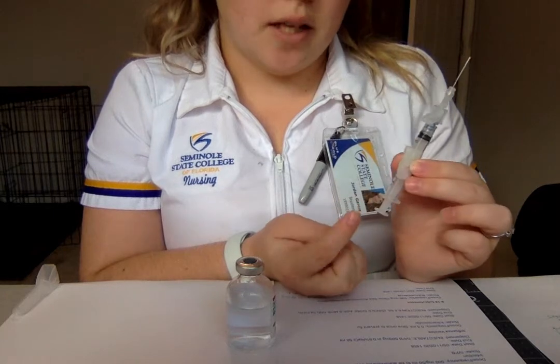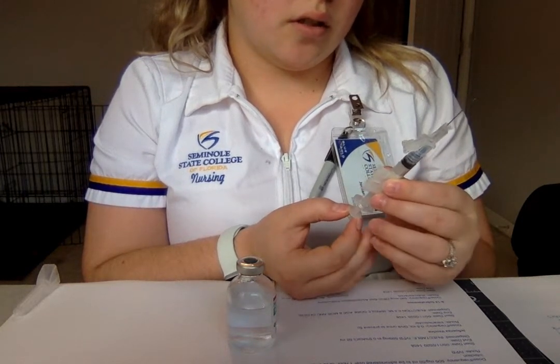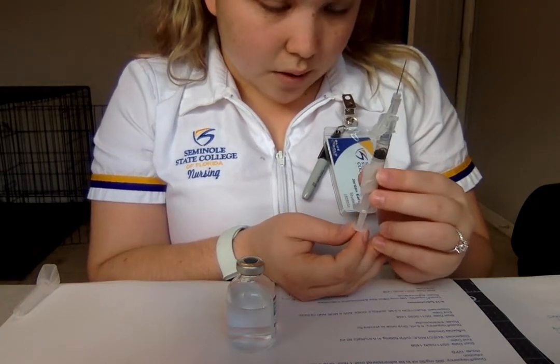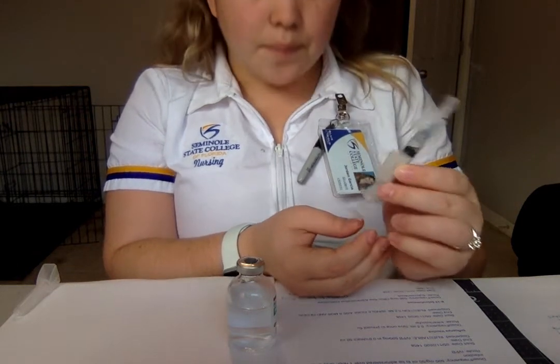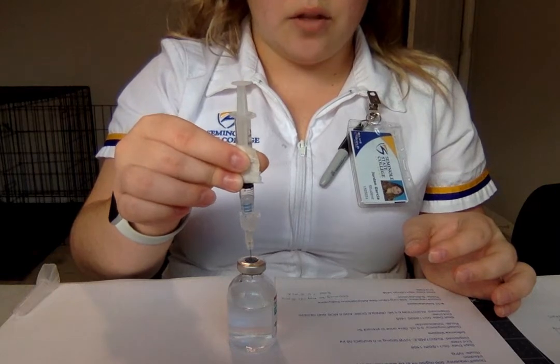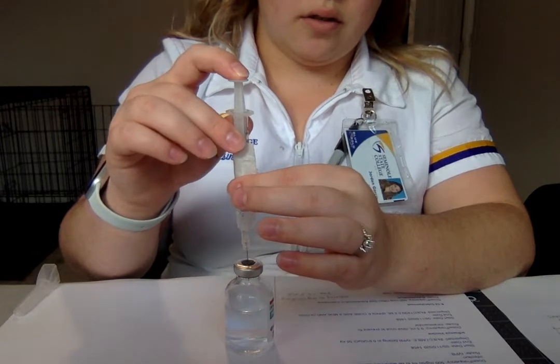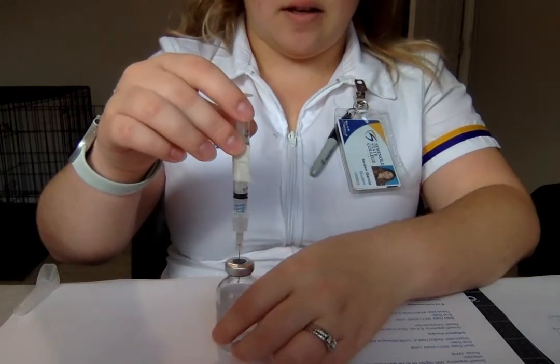And when I'm pulling it back, I'm going to be careful not to touch the plunger, just the little lip right here, so that I don't contaminate the plunger, because I don't want it to go into the patient. So 0.5 mLs of air. And I'm going to do it at eye level so I can get it correct. Okay. And then I'm going to insert the needle into the vial, and I'm going to inject that 0.5 mLs of air, air to air. Again, not touching the plunger so it doesn't contaminate. Okay, now I've injected the air to air.